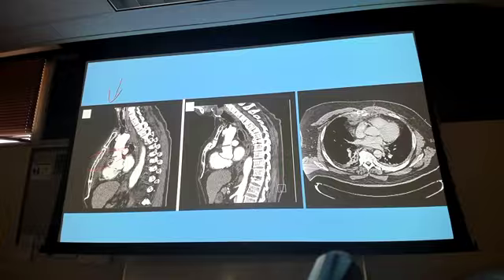This here is not a fracture, right? That is going to be from the sternal body to the manubrium, that's going to be that joint space there. So that's where the anatomy comes into play: is that a fracture or is that a joint space? No, that should be a joint space.